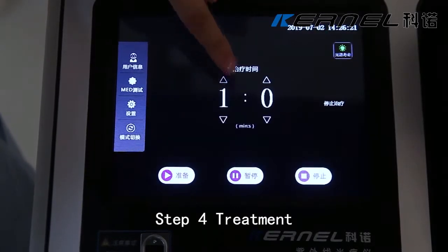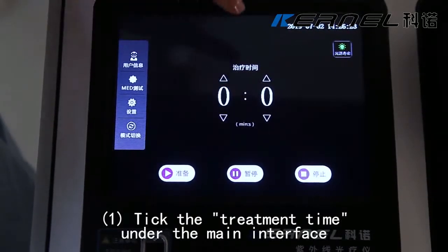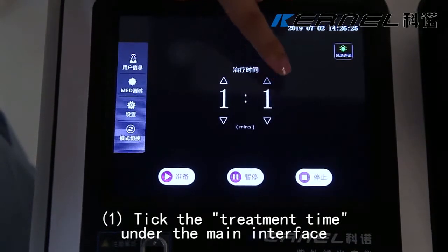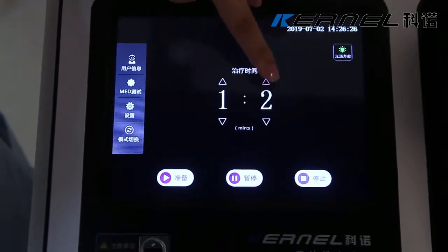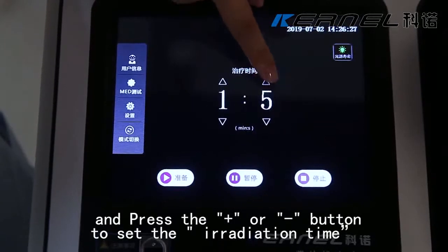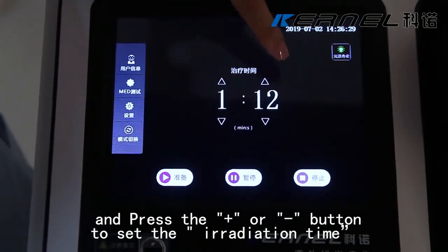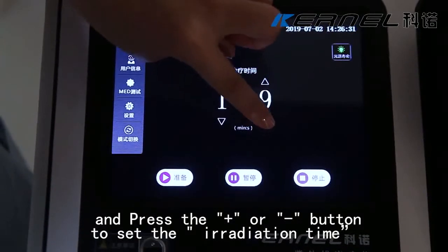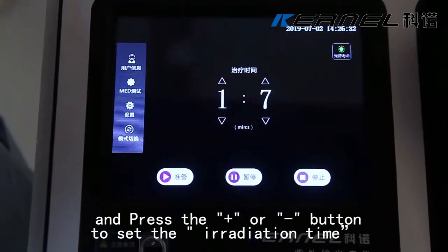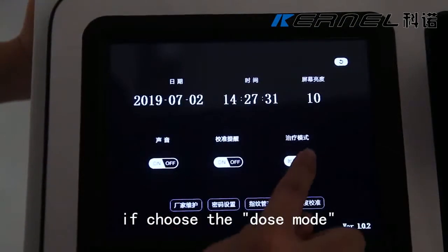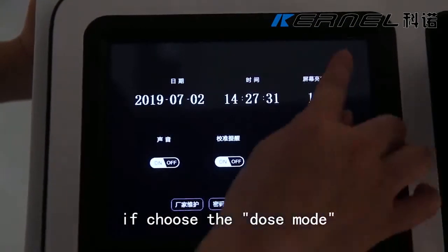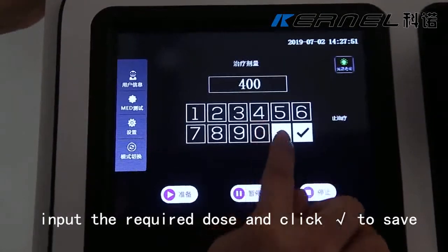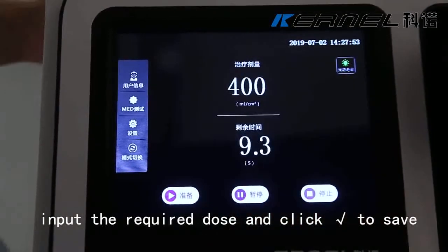Step 4: Treatment. Step 1: Tick the treatment time in the main interface and press the add or subtract button to set the irradiation time. If choosing dose mode, input the required dose and click the right button to save.